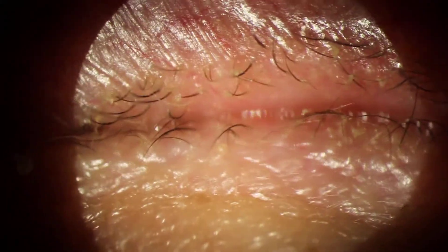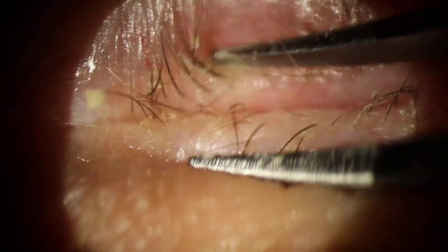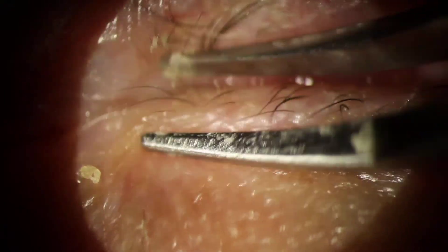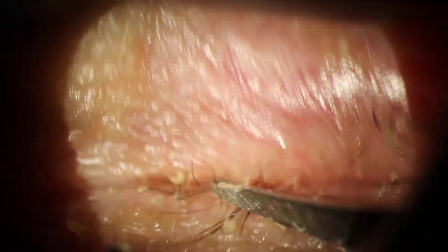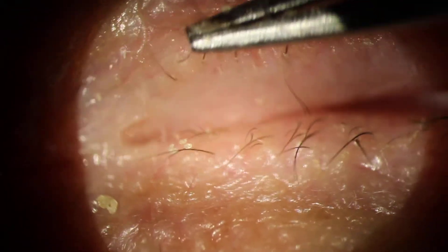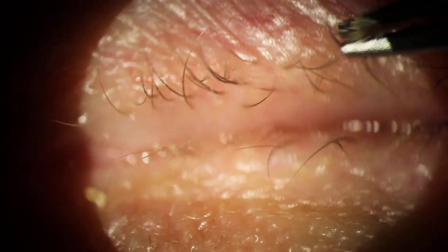Come forward a little bit. There you go. Okay. I'm going to pause there.